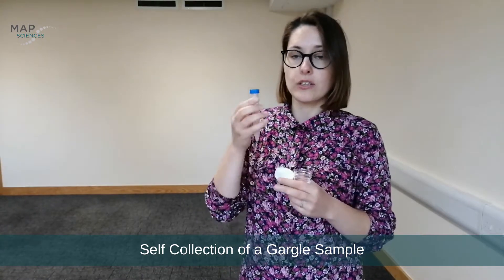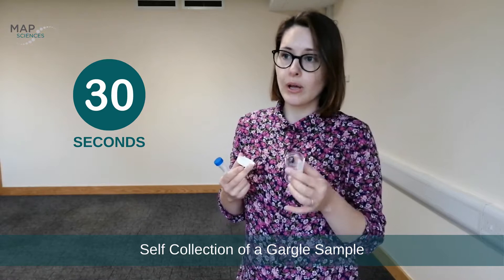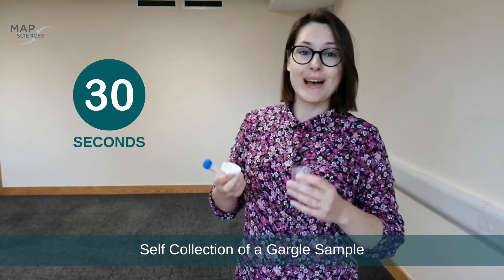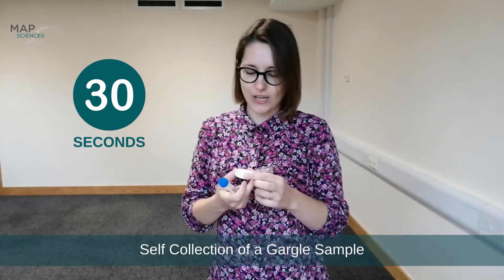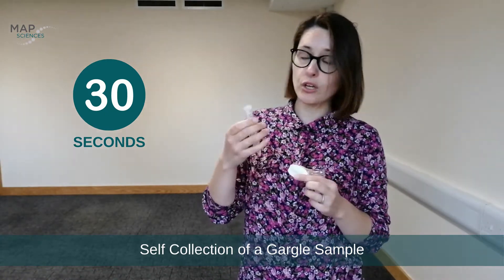Take the water to the back of your throat — do not swish it around your mouth. It is important to just gargle for 30 seconds. I will demonstrate how. Then spit your sample into the tube, put it back into the bag, and send it to us.